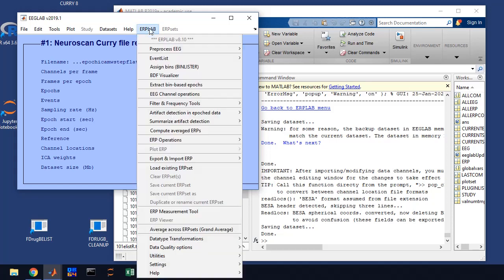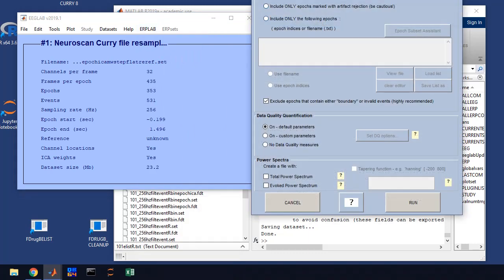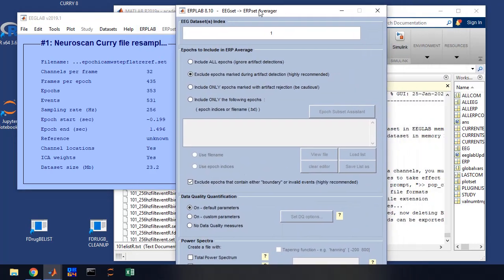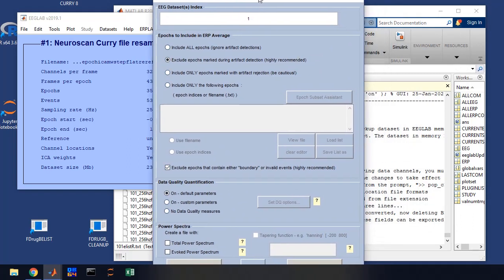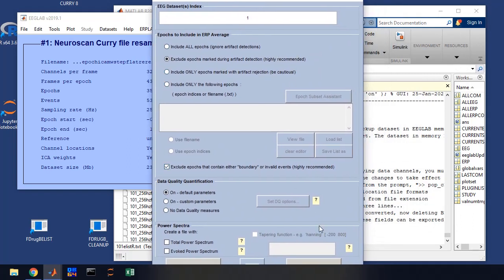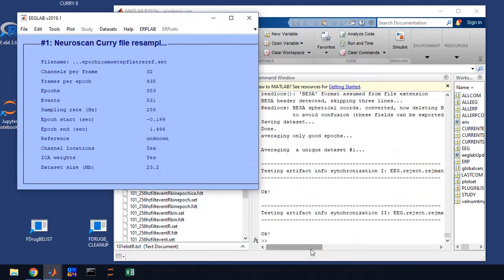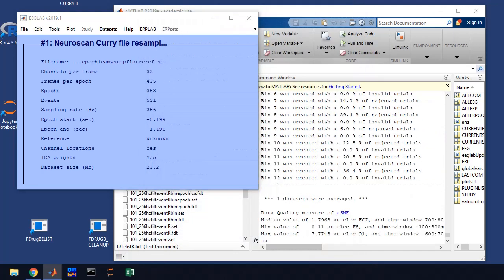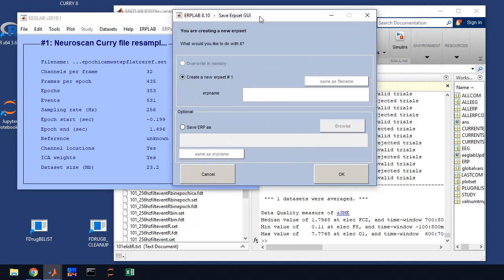This is pretty easy to do. You go to ERP Lab, Compute Averaged ERPs. You're going to get a window that comes up. Check your settings here with your protocol, but basically you're going to exclude epochs that are flagged, part of our artifact detection. So I'm going to click Run.